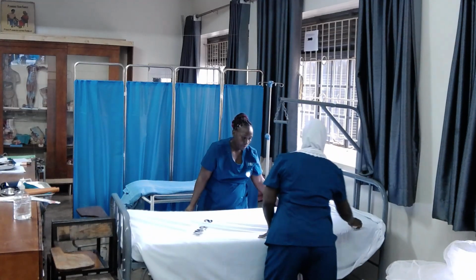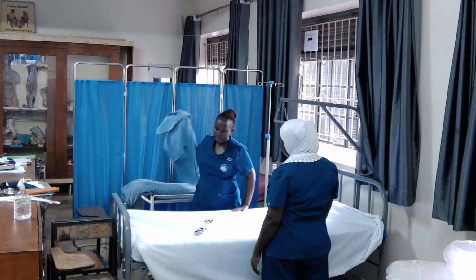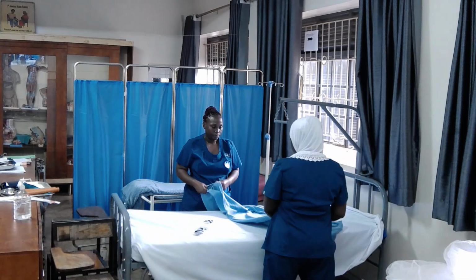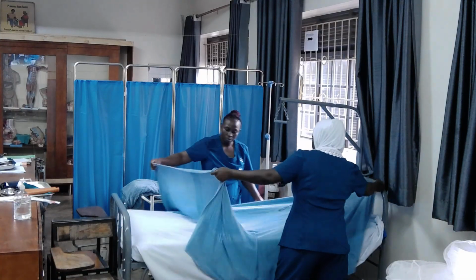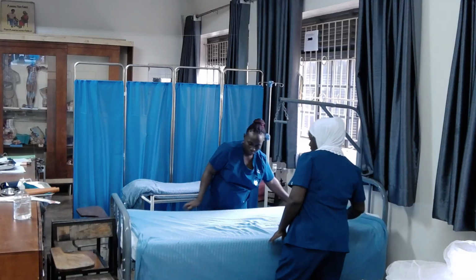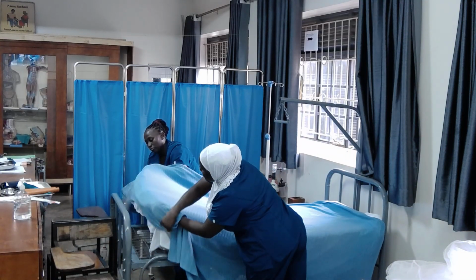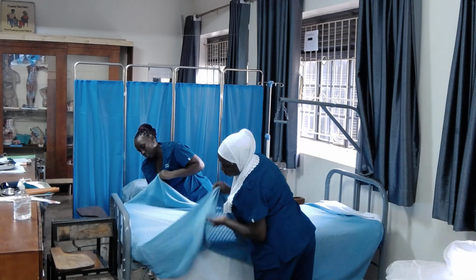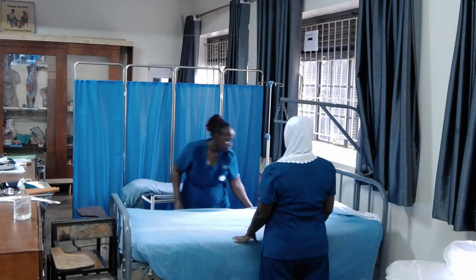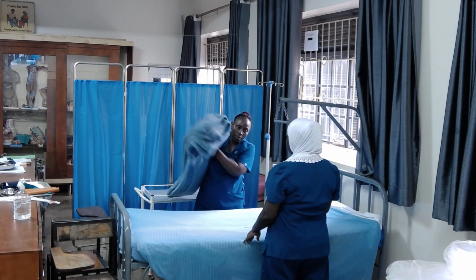We leave them hanging. We get our blankets. Now counter pin.